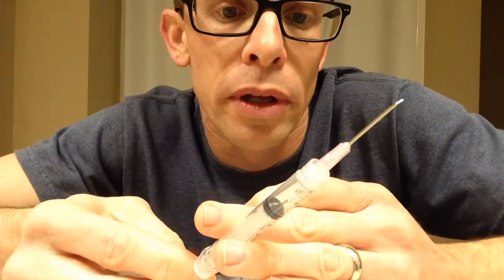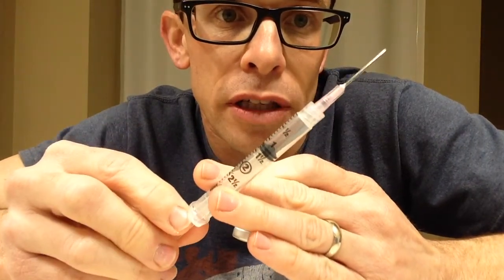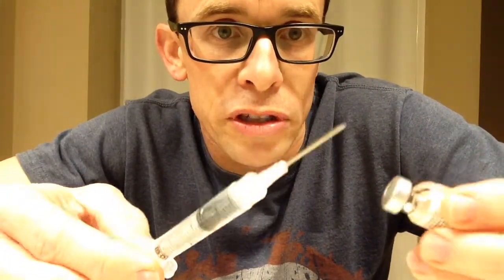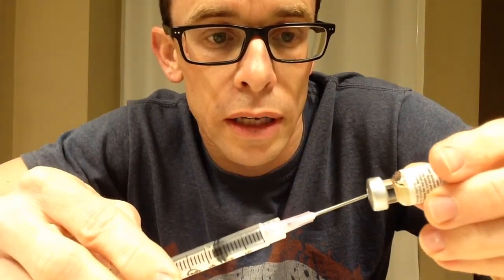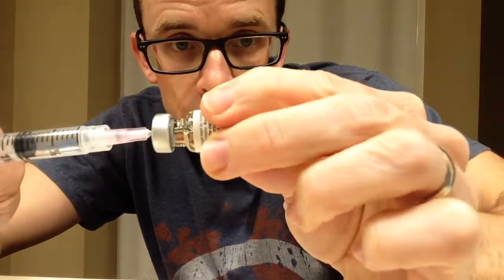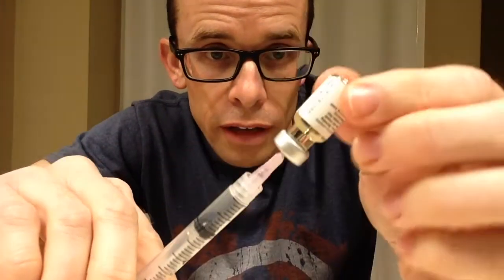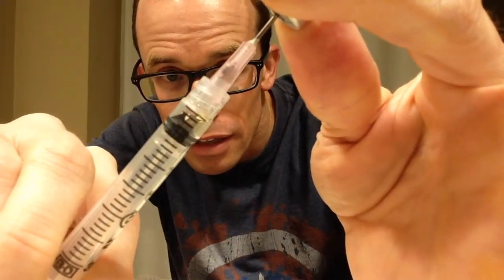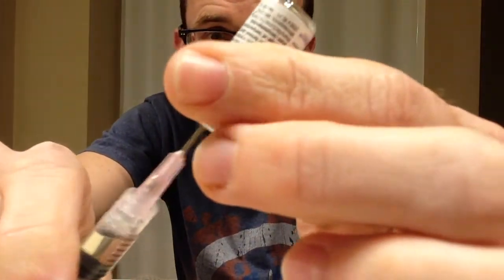So I'm going to pull it down to the 1, because that's actually 200 milligrams that I'll be taking, and then I'll push that air up inside there. So I've already alcohol swabbed that, so we're all clean. So just push that up inside, and then I push the air up inside there, and I don't think you'll see the bubbles, but it'll make these little bubbles. And then watch this as I let go. And so it's just sucking that in now.